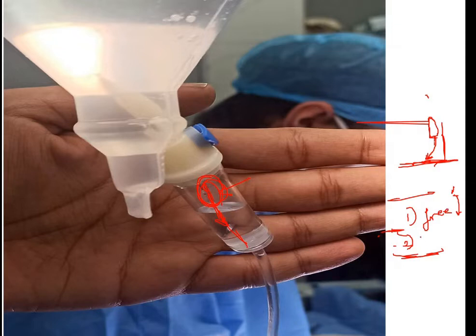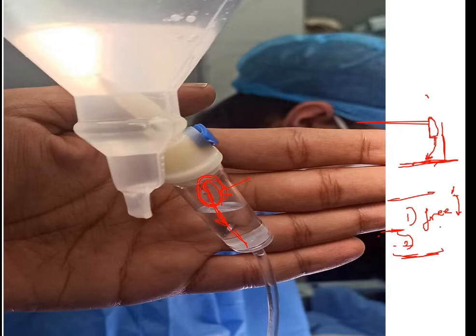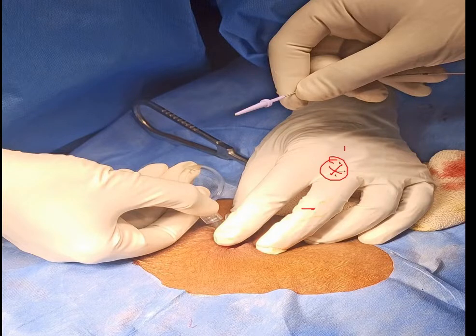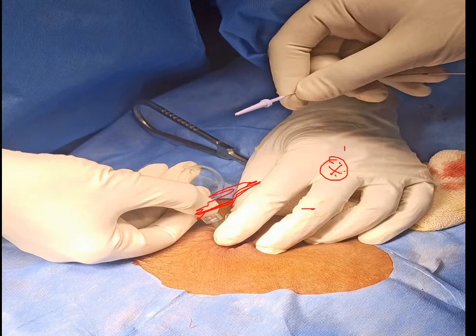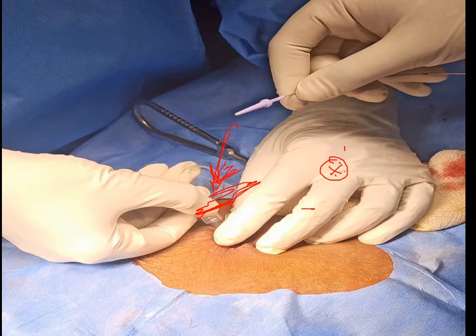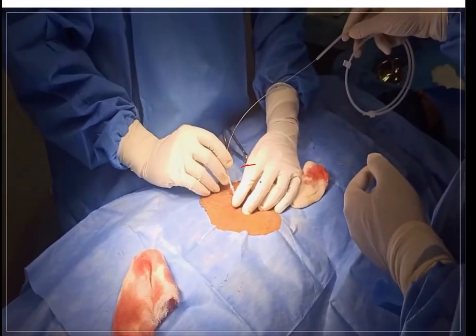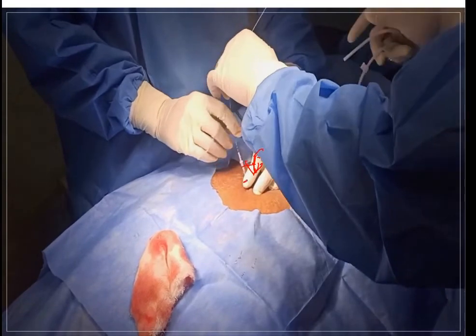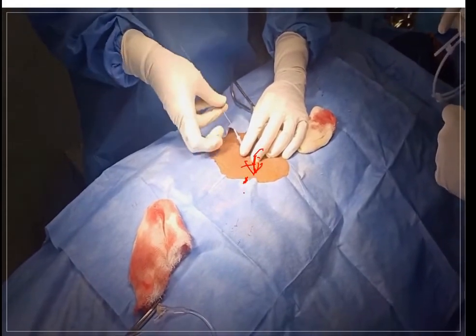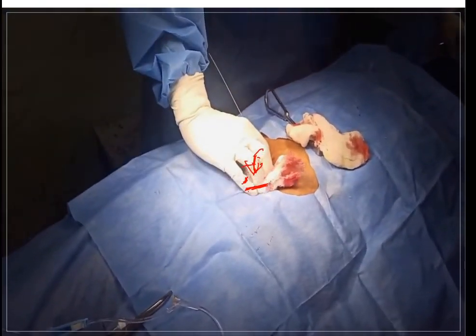So far we have dissected, inserted the gray cannula, and infused approximately one liter of fluid — the exact amount varies by patient, but up to one to two liters may be required. The next important step is guide wire insertion. We disconnect the PD fluid and insert the guide wire through the gray cannula, similar to IJV catheter insertion using the Seldinger technique. The guide wire should pass smoothly with no obstruction; one hand must hold the gray cannula firmly throughout.